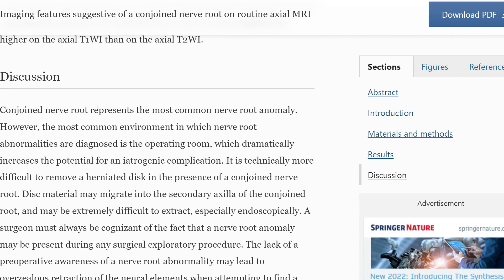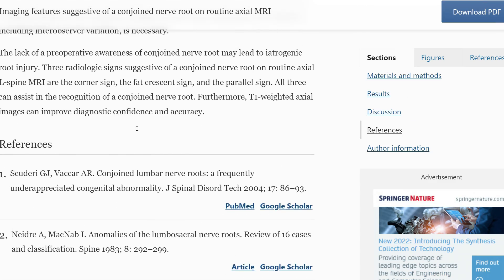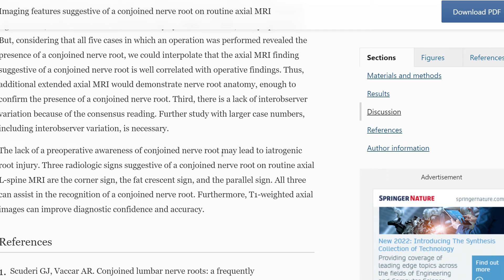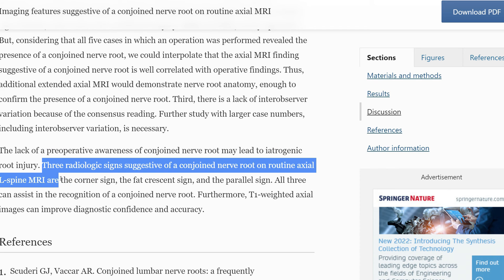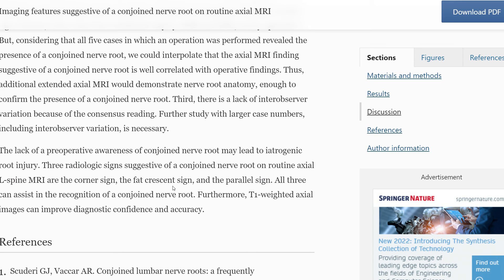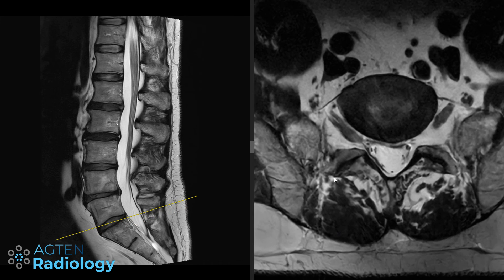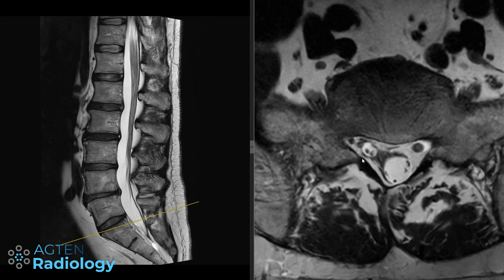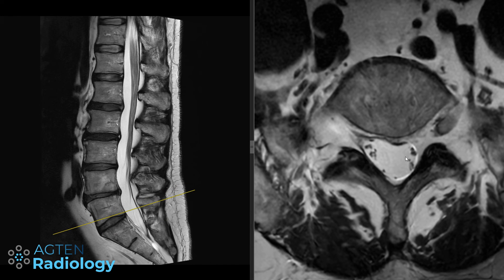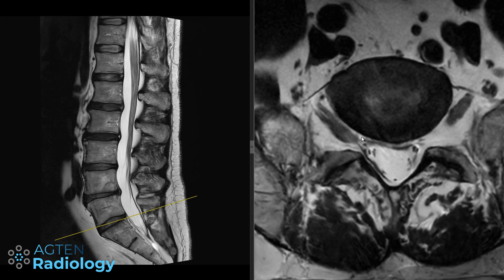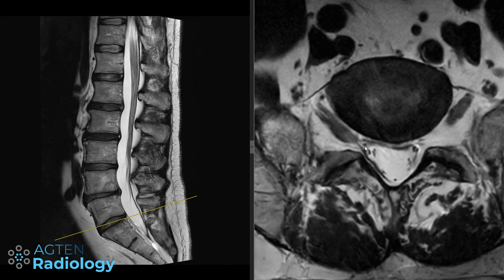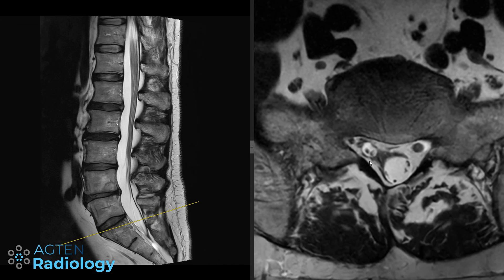The article concludes that lack of preoperative awareness of a conjoint nerve root may lead to iatrogenic root injury during decompression and discectomy. The corner sign, fat crescent sign, and parallel sign on routine axial lumbar spine MRI are suggestive of a conjoint nerve root. Going back to our images: here we have the parallel sign — the nerve root visible in one plane — and the asymmetry of the dural sac. The fat crescent sign is not clearly visible in our cases, but it's something to look out for.